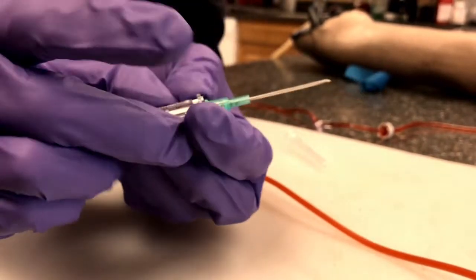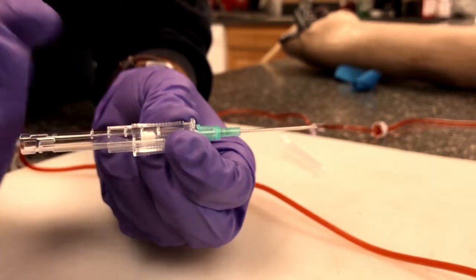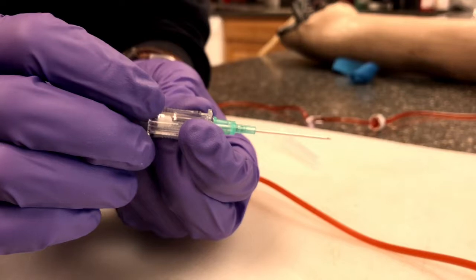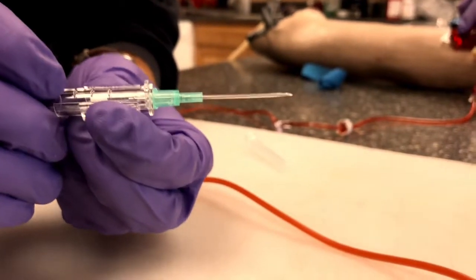So you'll get a partial flash in your flash chamber, and that tells you that the needle's in. If you start trying to advance at that point, the catheter will bounce off the edge of the vein. So you need to put a little bit further into the vein to get the catheter in there, and you'll know that that's happened because you'll get a full flash. So that's something that's very, very common.